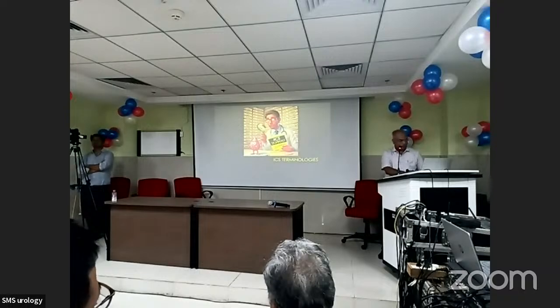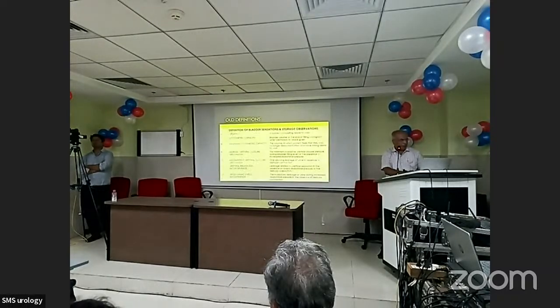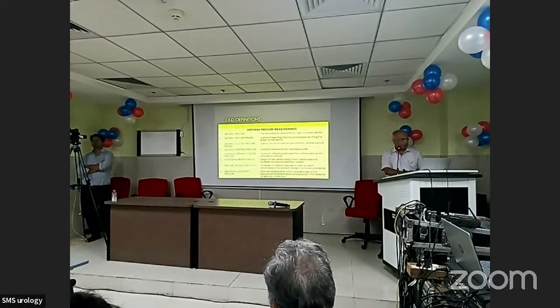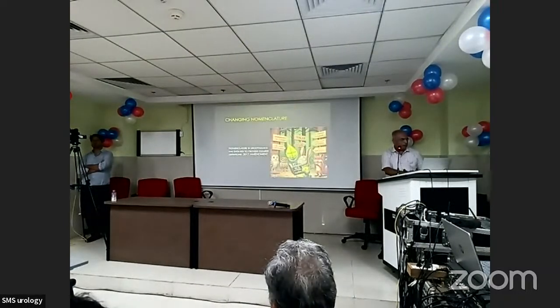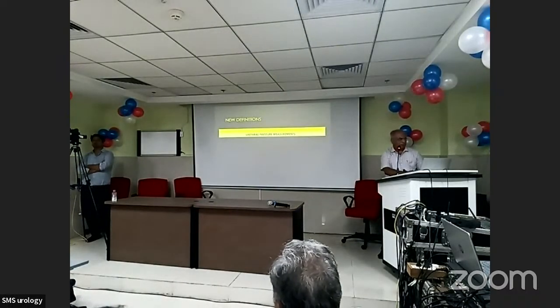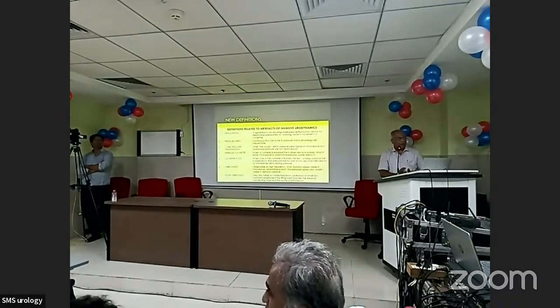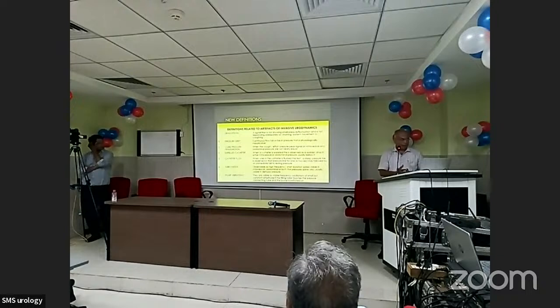Now, ICS terminologies. Since 2002, a few things have remained the same. They are the same for theoretical importance. But after 2017, a few new terms have come up, of which the very important point is that there has been no change in urethral pressure measurements. It has remained the same, and very significantly, artifacts have been added to this definition. Now we know what a dead signal is. We actually have to mention it on paper.